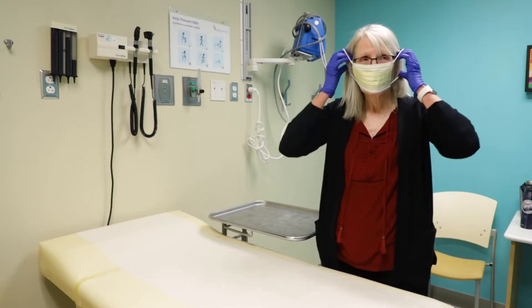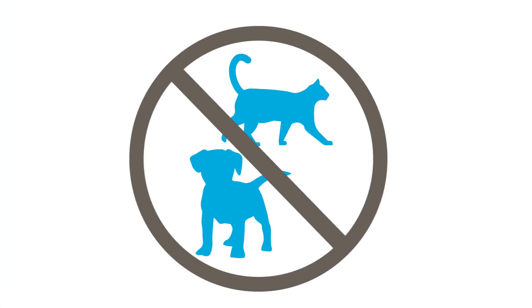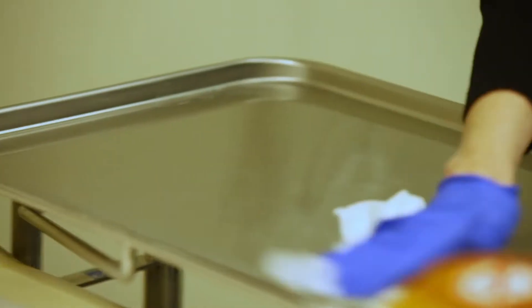When changing the dressing, you, your child, and any helpers should wear a mask. This is to make sure you don't breathe near the open line. Keep pets out of the room. Choose a clean, flat surface where you can set up your supplies. Clean the surface using a bleach wipe.